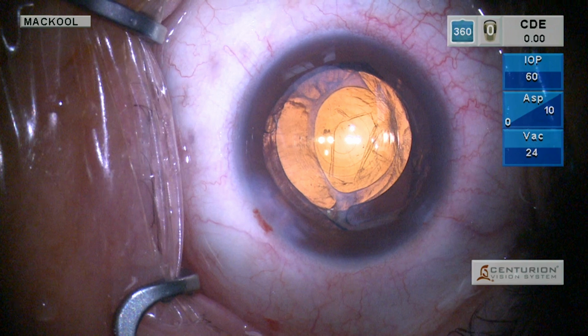And I can tell you that postoperatively this patient did extremely well, had no distance or near vision problems, and we're waiting to see what happens with any nocturnal glare or halo as to whether or not to enlarge that posterior capsulotomy.